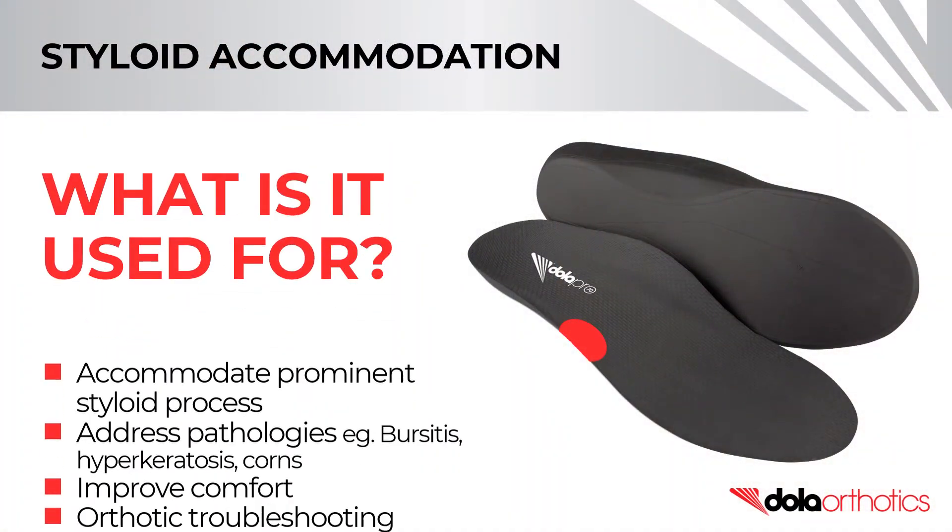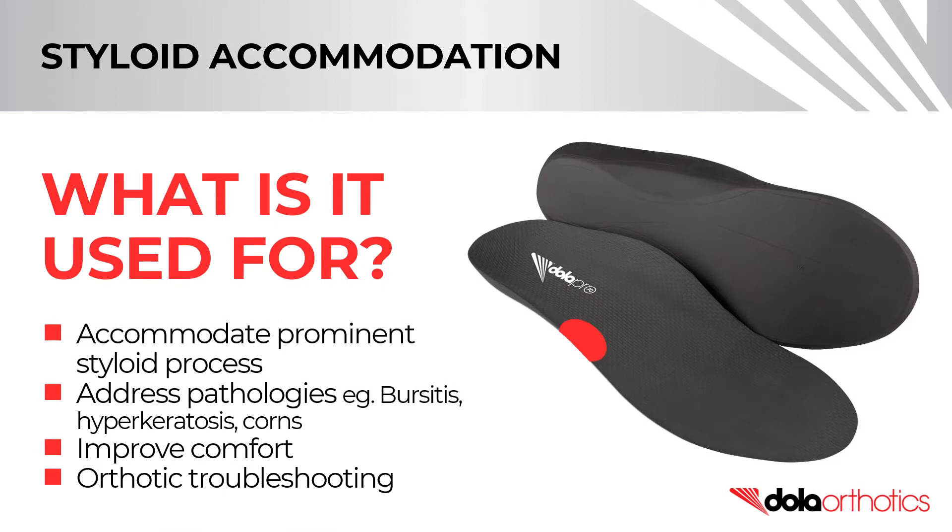A styloid accommodation can be used to accommodate a prominent styloid process, plantally or laterally. It can also be used to address pathologies including bursitis, hyperkeratosis or corns, and to improve comfort, tolerance, and to troubleshoot orthotic irritation.